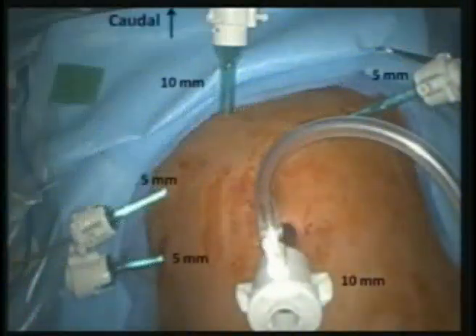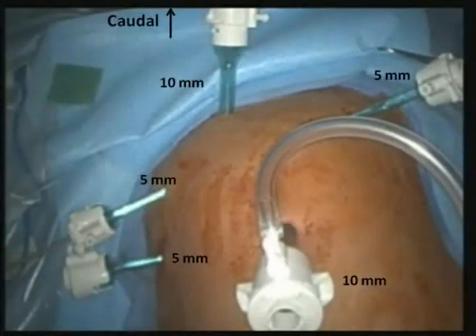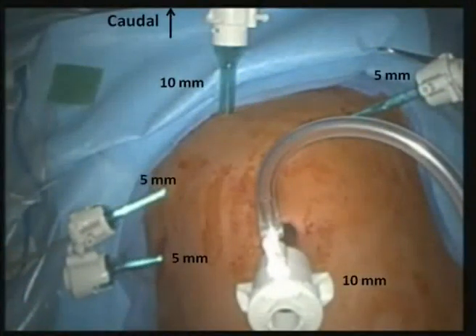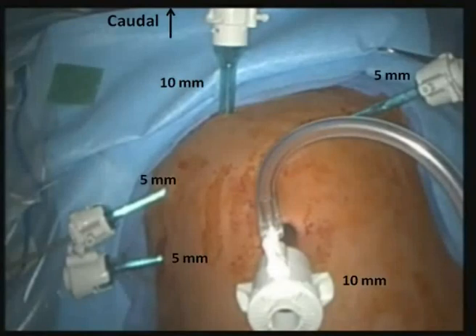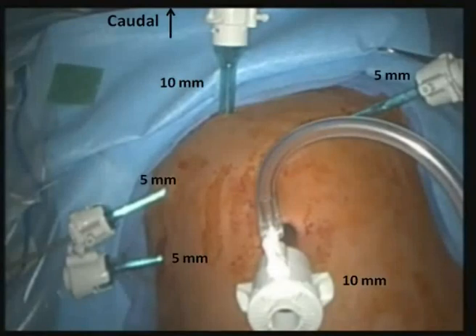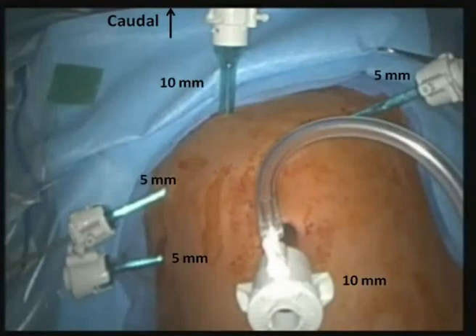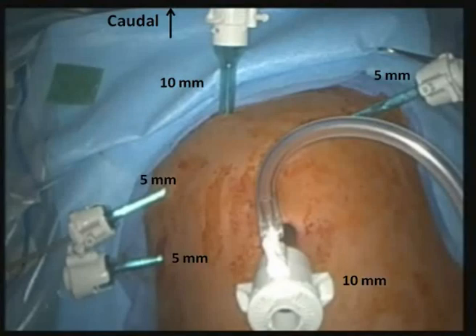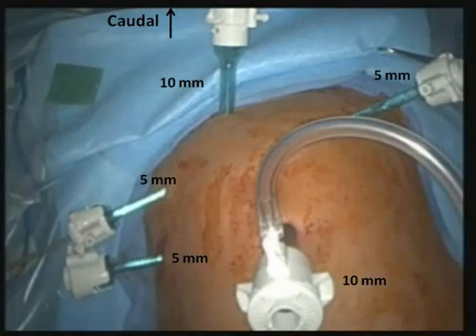A five-trocar approach is taken: two 10-millimeter trocars — one in the umbilicus and one in the suprapubic area — and three 5-millimeter trocars — one in the right lower quadrant and two on the left to facilitate periaortic lymphadenectomy.